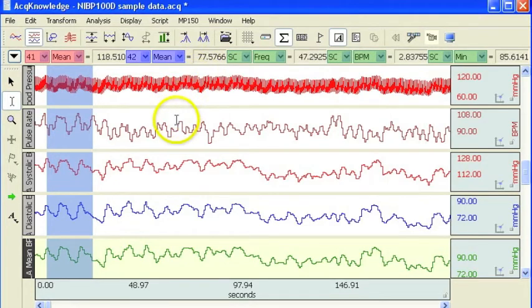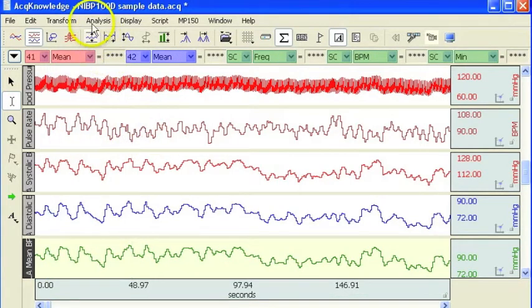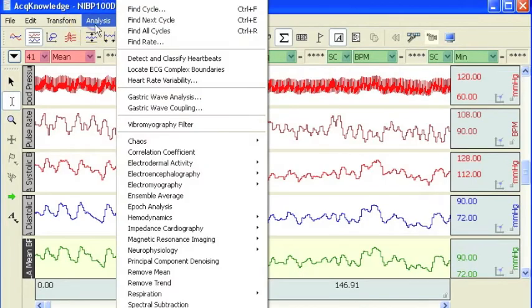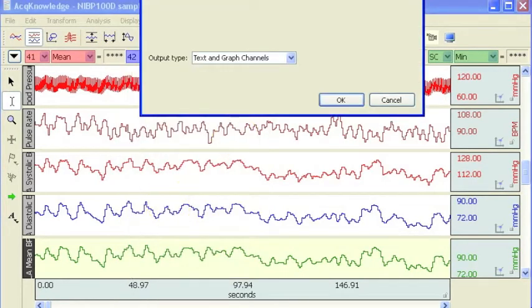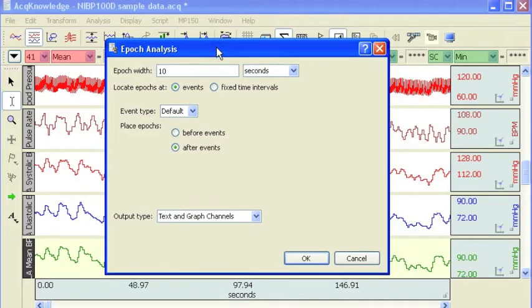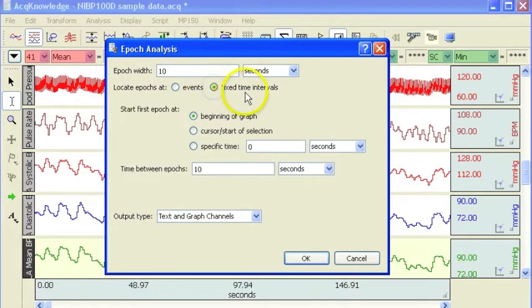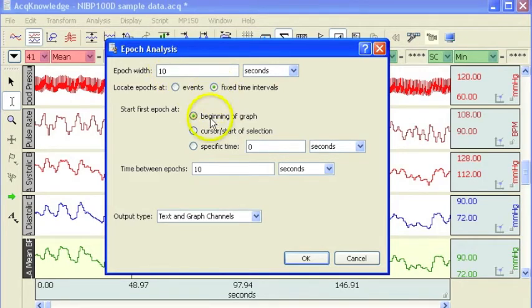It's also possible to automate this procedure by using the fine cycle peak detector. There is a nice tool located in the analysis menu, Epoch analysis, that will allow us to automate this process. I'm going to use a fixed time interval and I'm going to take a measurement over a 10 second time window.